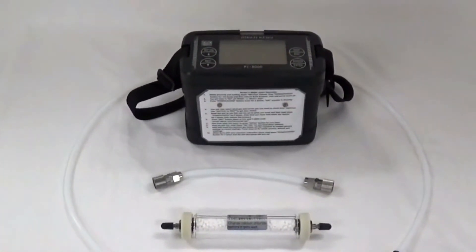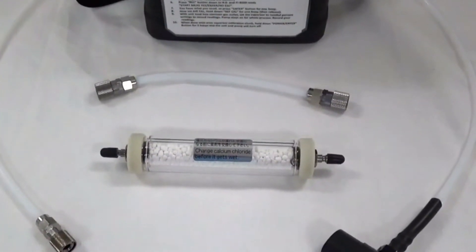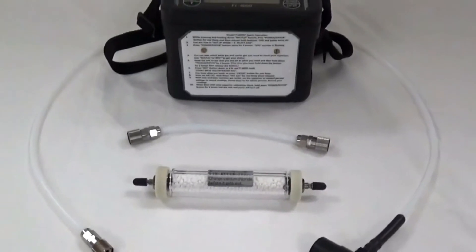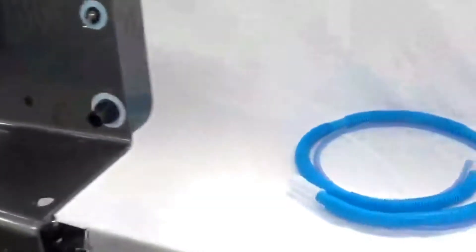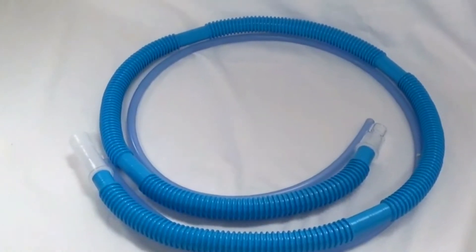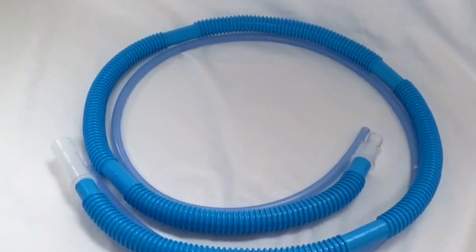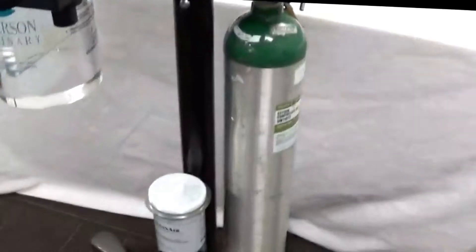The Reichen Fi 8000 comes with a 6-inch Teflon tube with quick connects, a calcium chloride filter, and a 3-foot Teflon tube with a quick connect and a sampling tee on the other end. We will also be using the Reichen gas scavenging kit, which includes a 5-foot quarter-inch silicone tube and a 5-foot 19-millimeter hose that are teed together to connect to the clean air canister.